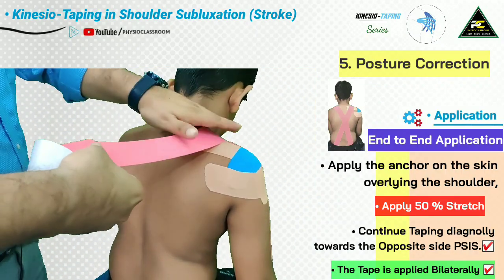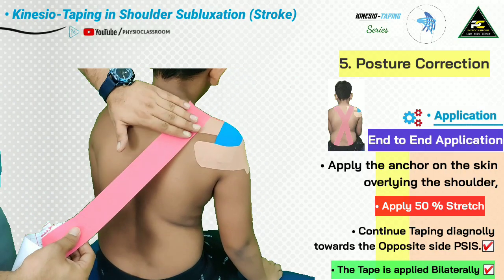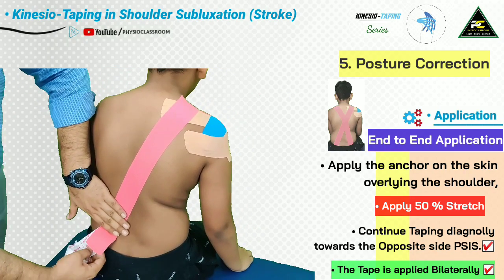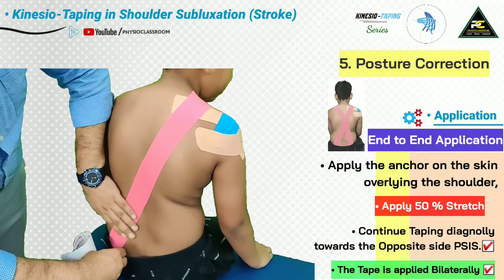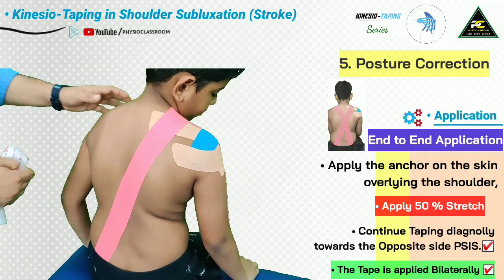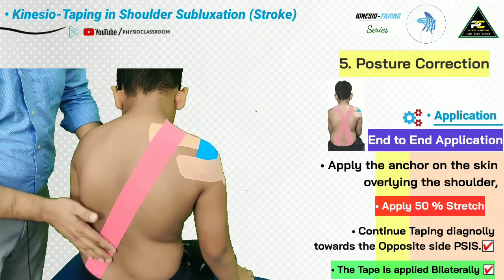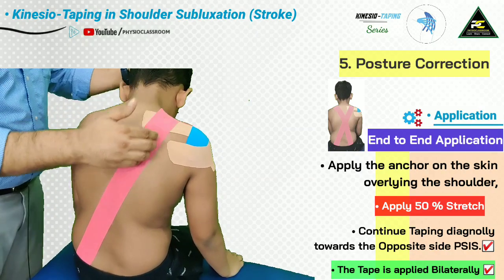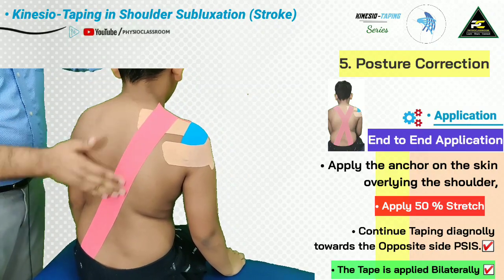Stabilize the first anchor, remove the paper backing while keeping the last portion, then ask the patient to sit straight. Apply around 50 percent stretch, and the remaining part is applied with no tension. Whenever the patient tries to go into a hyperkyphotic posture, the tape stretches and stimulates the mechanoreceptors in the skin, which sends a signal to the brain to reduce this tension — so the patient learns to sit in a position where the tape has less tension.